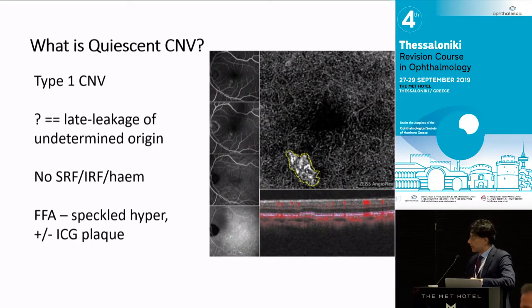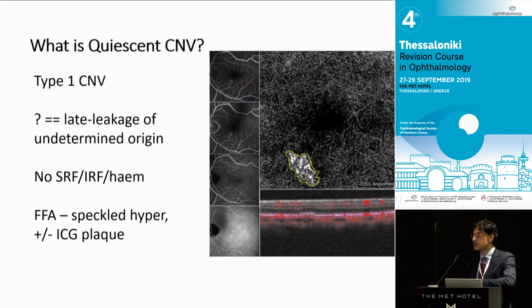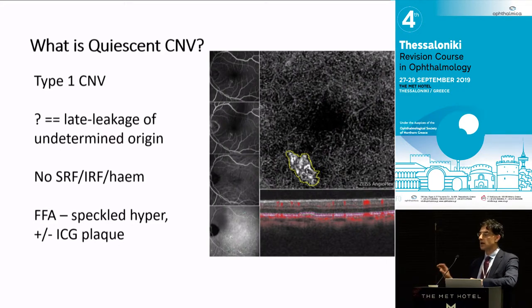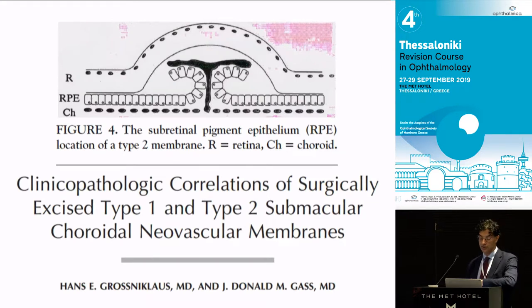Quiescent CNV is a form of type 1 CNV. If you look at the fellow eye, you will see a shallow separation between the RPE and Bruch's membrane that is medium hyperreflective with no fluid. The patient may be relatively asymptomatic. On fluorescence there may be some very late, slight speckled leak — probably the correlate of what was historically called late leakage of undetermined origin. There may also be a plaque on ICG.